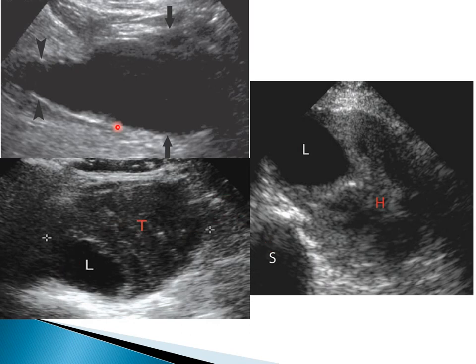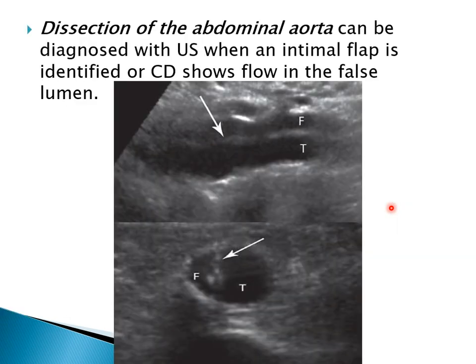This is the abdominal aortic aneurysm, large aneurysm seen here. This is the thrombus and the narrowing of the lumen. Here we have rupture aortic aneurysm, hemorrhage, and this is the spine, heterogeneous area seen around the lumen of the aorta. We should suspect that there is rupture. Sometimes you have dissecting aortic aneurysm. This is intimal flap between the true lumen and the false lumen, as seen here in the axial section.